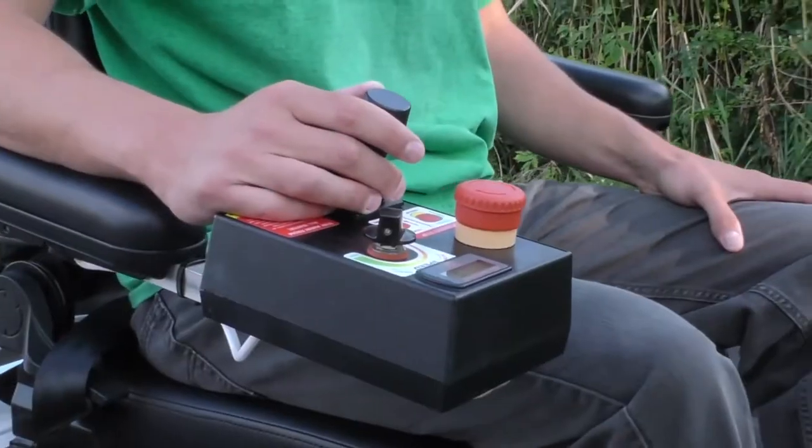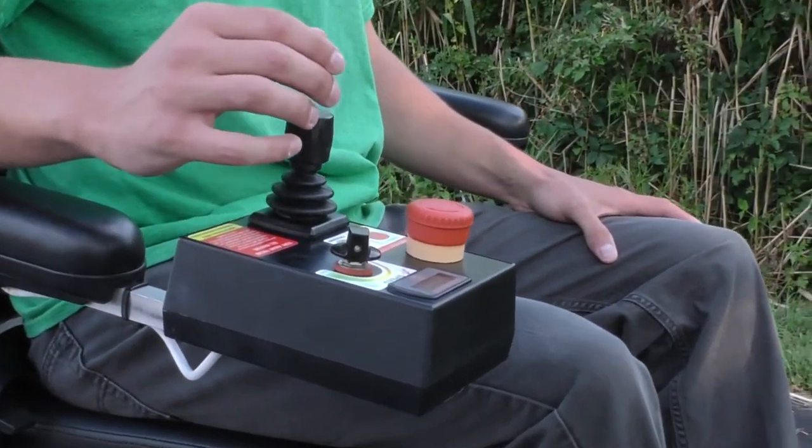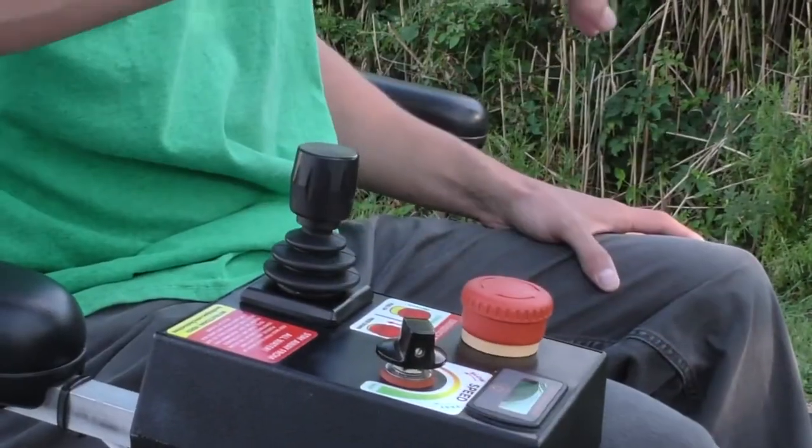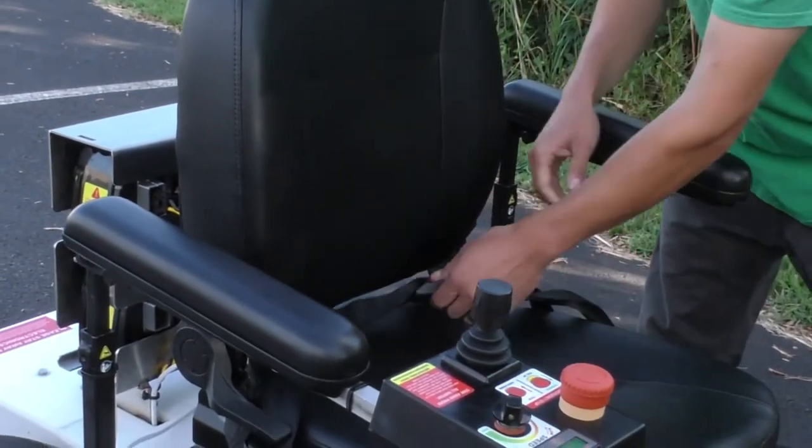When you are driving, the best way to stop the wheelchair is to simply let go of the joystick — the chair will slow down and come to a stop. However, if you need to stop very abruptly, you can press the red button down. When we deliver the chair, the seat belt will be tucked through the seat so that it is not dragged while we were unloading the chair.